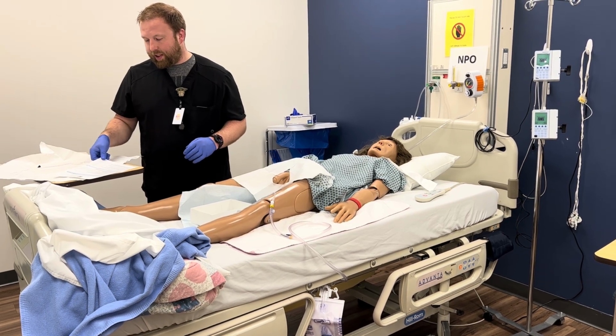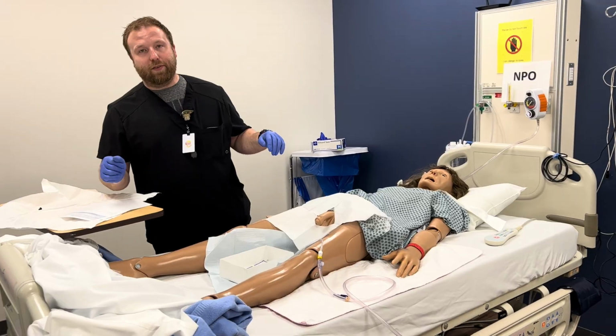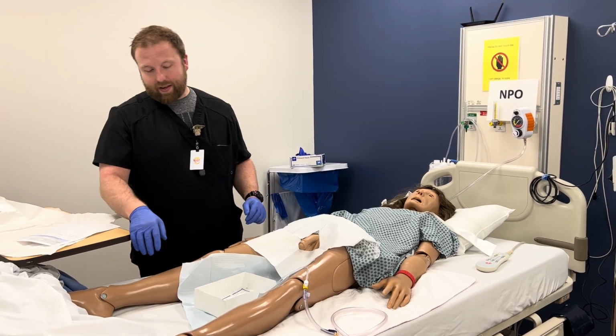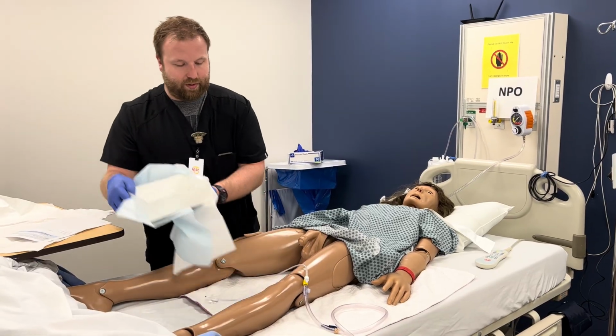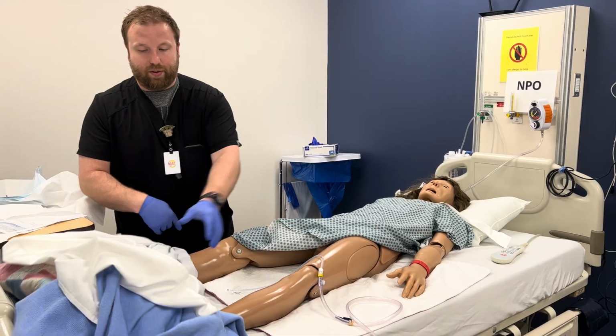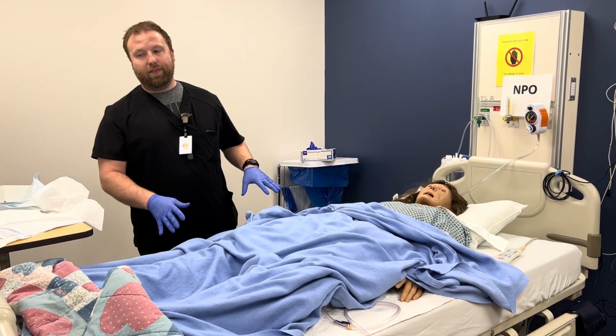Remove my gloves, wash my hands. I would put clean gloves on before I'd have done that. I've maintained my sterile field for the whole thing. I will cover the patient back up. I'm going to dispose of my supplies. I'm going to cover the patient back up, making sure we're in a comfortable position.